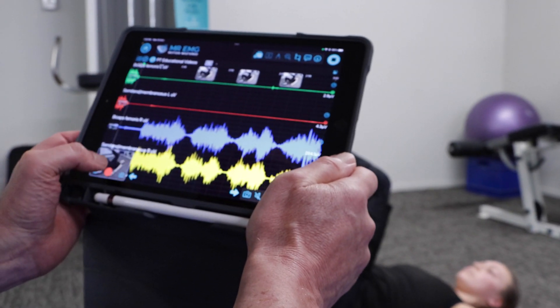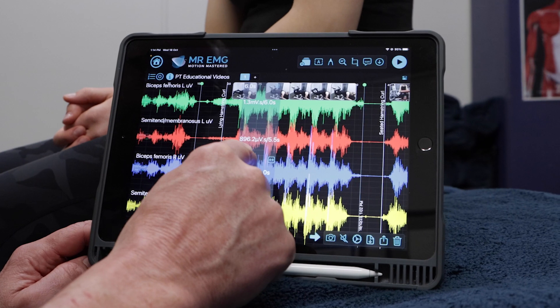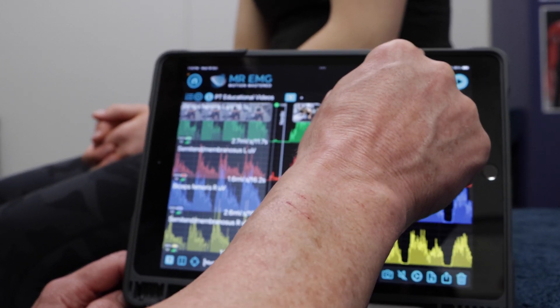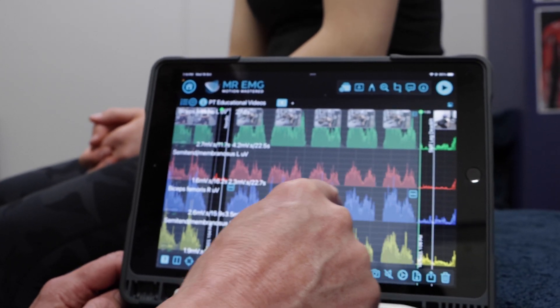Let's review the data. Compress your data by closing your fingers on the iPad screen. Place selections over each exercise recording and set the amplitude view to rectify. This lets you assess the level of muscle contractions for each exercise. Take note of the levels of microvolts for each muscle during each exercise.